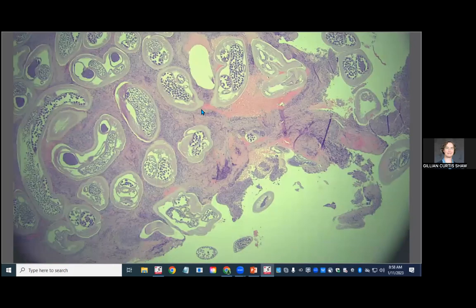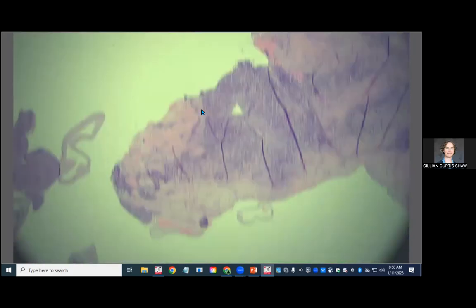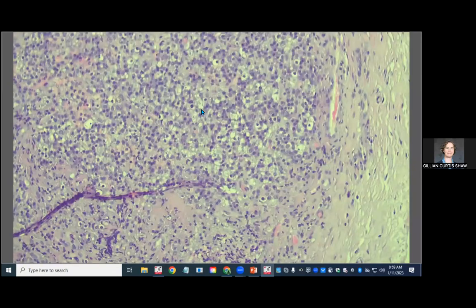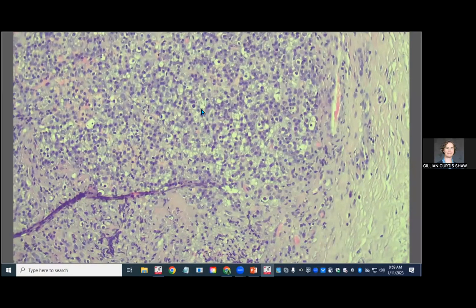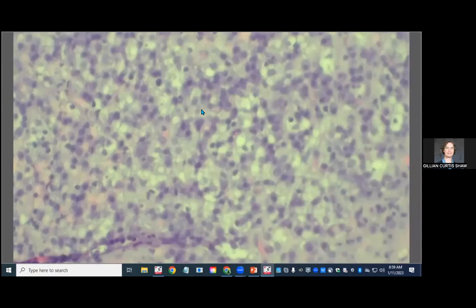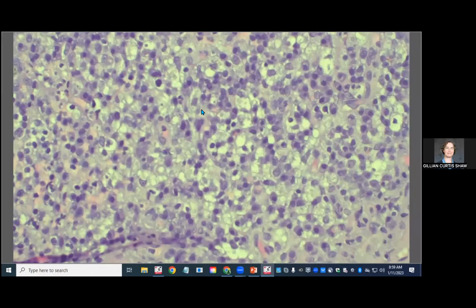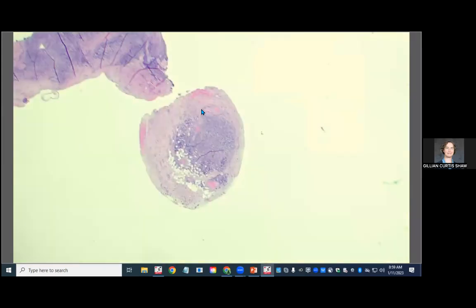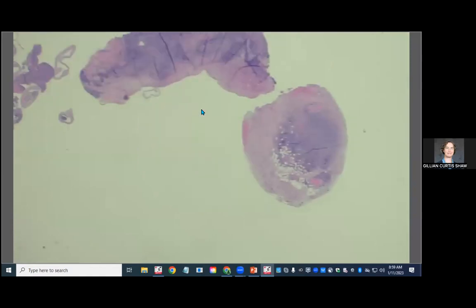So that's just a cool case. Both eyes had them. It often will elicit a granulomatous, lymphoplasmacytic, eosinophilic response, which is most prominent when the nematodes die. Sometimes that can happen just because of the life cycle of the worm, or because it's been treated with ivermectin or something like that. So this one has much more of a chronic lymphoplasmacytic and granulomatous inflammation scattered about. Sometimes we only get little nodules of inflammation with or without remnants of dead parasites.